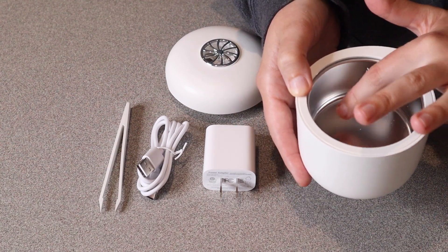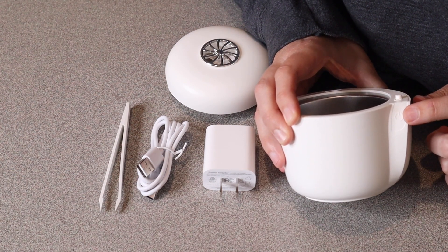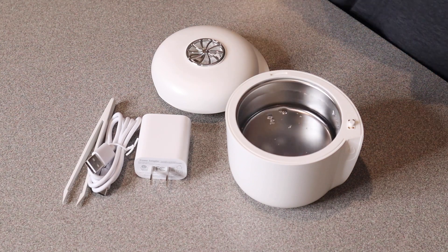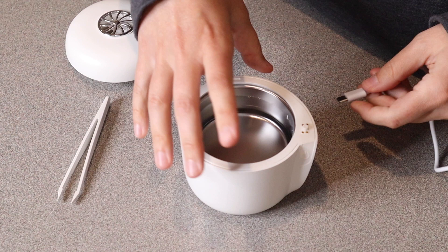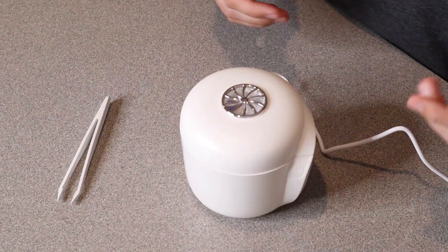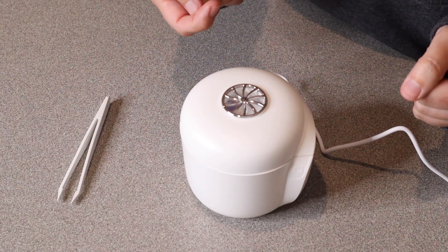In this bottom section we have a little max fill line. This is the actual cleaning tank itself where you're going to add water. Then on the outside we have the power button right here. I just filled it just about to the max fill line. Now I'm going to go ahead and plug this in — you can see the little plug is in the back. Once you press the power button you can tell it's turning on when the fan is on.